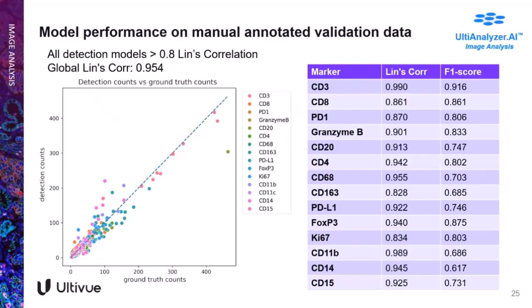Of course, it's deep learning. I mean, this is tested on a certain data representation. If the data we want to analyze is very different, we have to extend the training data and also the testing data to incorporate that.